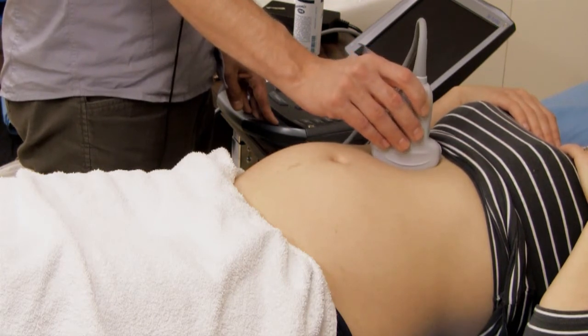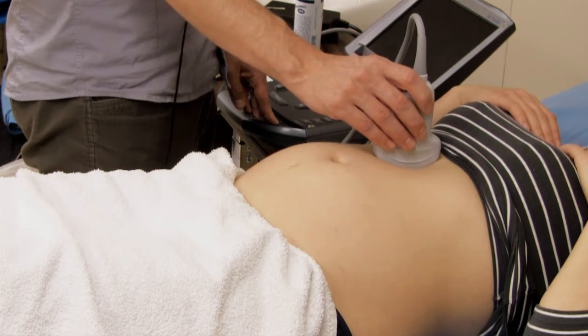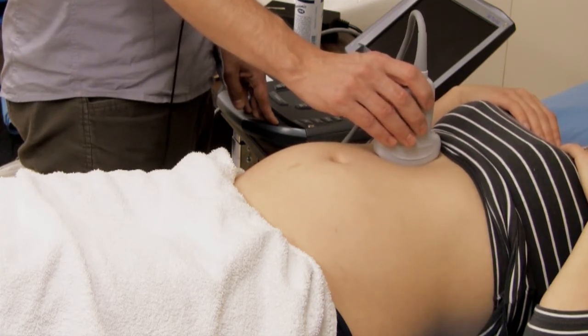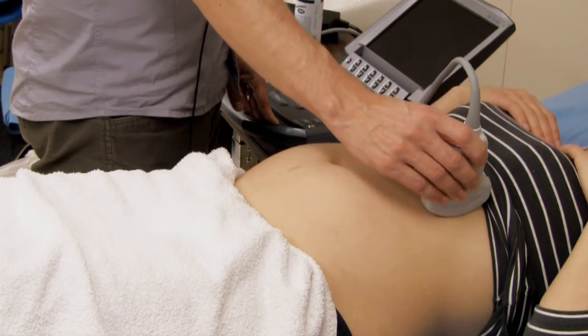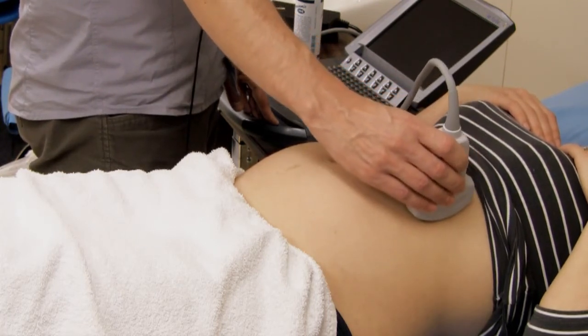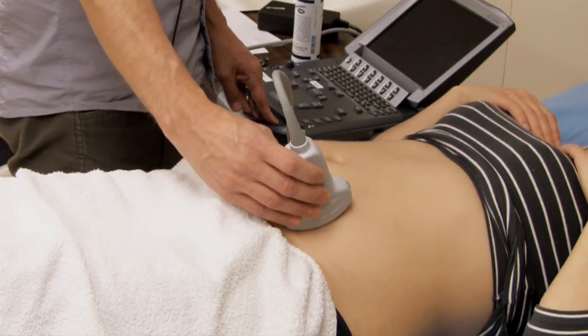At this point, you will have assessed the fetal head and spine in 2 of the 4 uterine quadrants. The next step is to assess the remaining 2 quadrants. Slide the probe across the abdomen into the other upper quadrant and then down into the remaining lower quadrant. Ensure that you do not see another fetus.